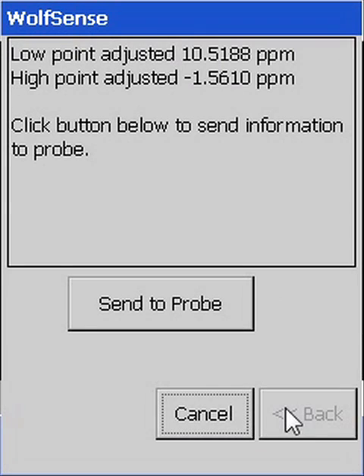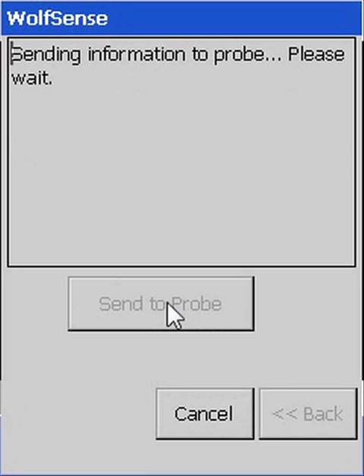These readings show how much of an adjustment you have made. Upon completion, send your user calibration adjustments to the probe that is being calibrated, where it is stored on an internal chip.